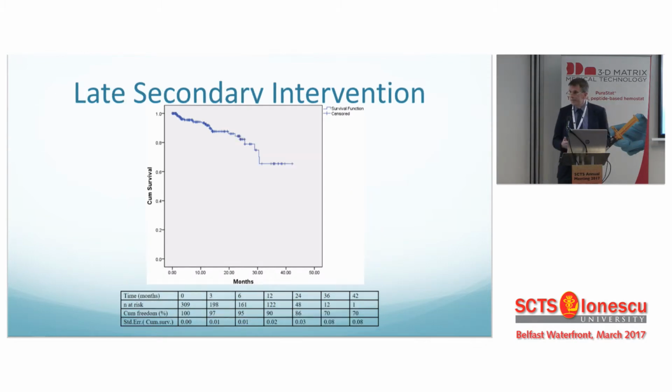Late secondary interventions, as we have already spoken, affect the cost effectiveness, but there wasn't a cost effectiveness analysis in this, and about 30% of patients at 3 years were in need of secondary interventions.